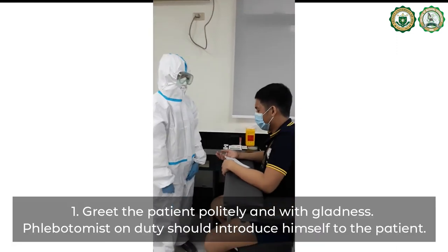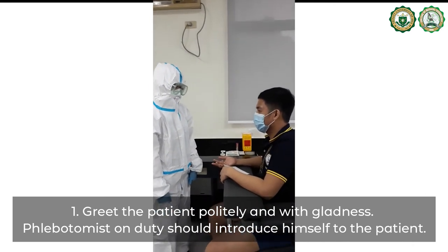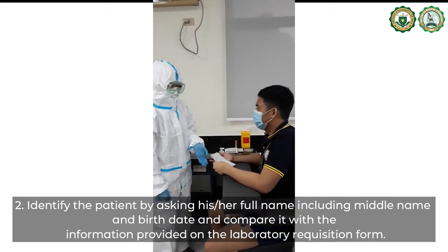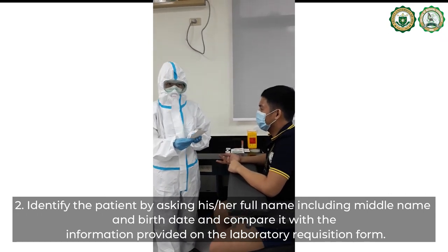Greet the patient politely and with gladness. The phlebotomist on duty should introduce himself or herself to the patient. Identify the patient by asking his or her full name, including the middle name, and the birth date.